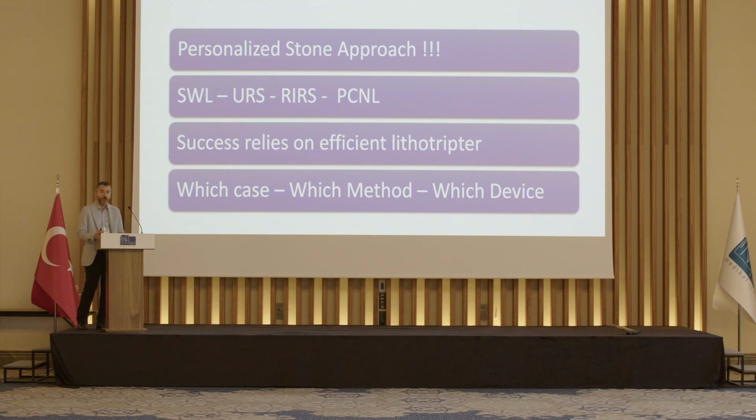But in the end, if you are applying shockwave lithotripsy, the success of the procedure, the stone-free rate, actually relies on an efficient lithotripter. So if possible, we need to have everything in the OR, and we need to know for which case, which method, and which device, so that we will be successful and will serve our patients with excellent outcomes.